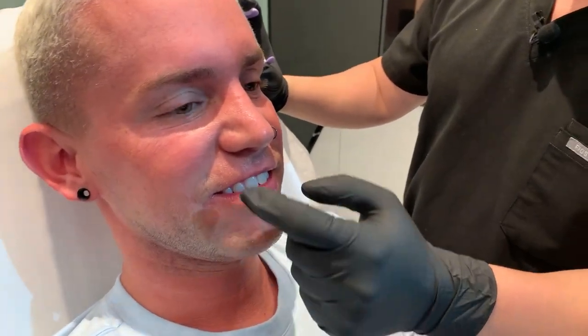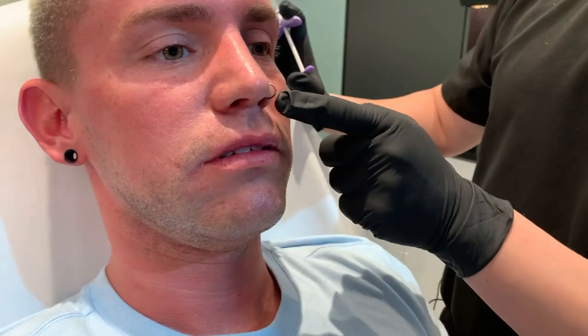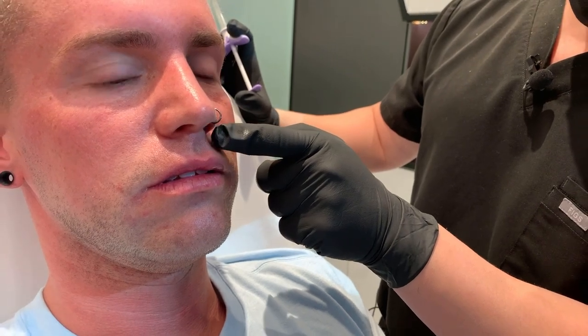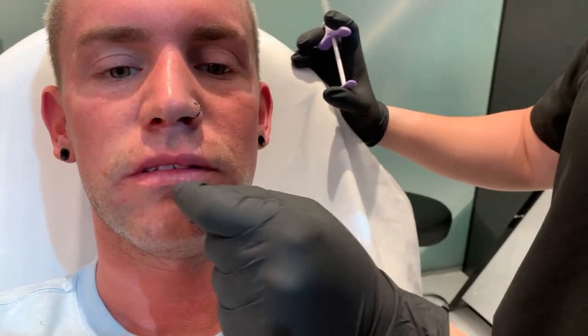So with him, to his upper lip, he really doesn't have a lot. So it's gonna be a little more difficult to give him a full lift without doing a surgical lift or something like a Botox lip flip, but we're gonna work our magic to try and give him a little more lip show and a little elevation. Same thing on the bottom.